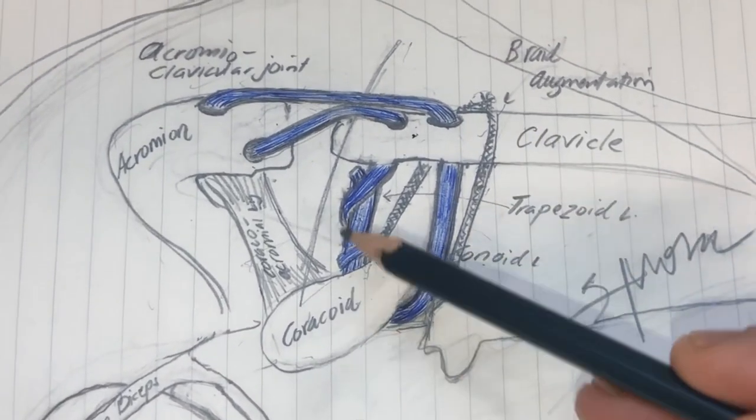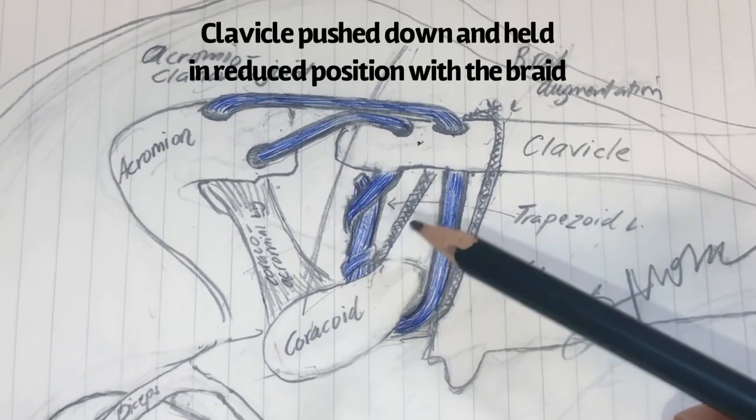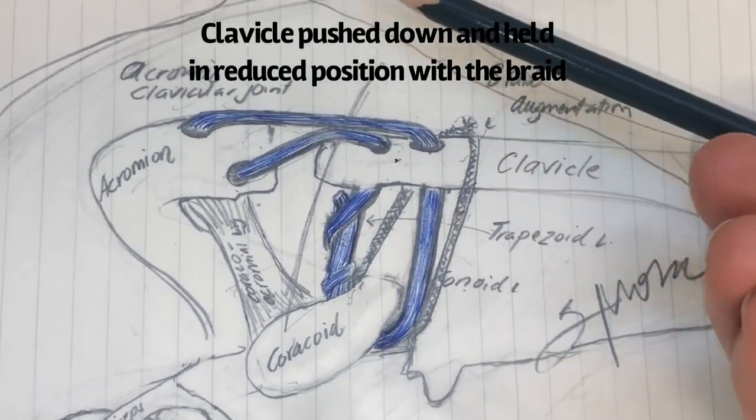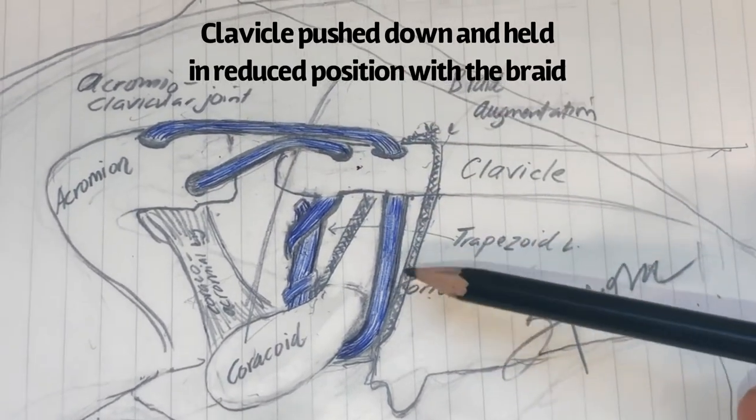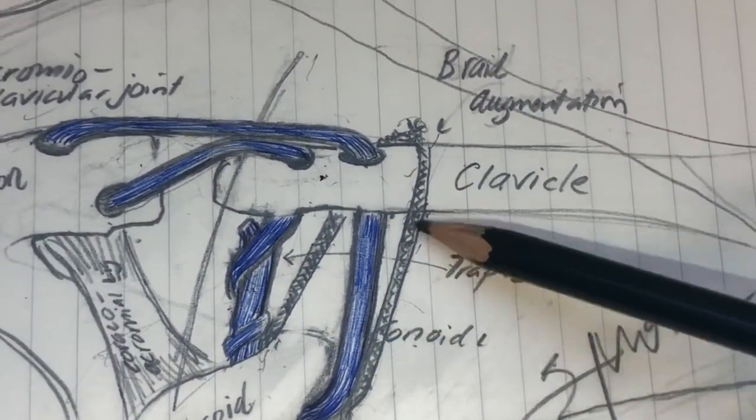Once I loop both structures through, our passable structures, then I reduce the clavicle, bring it down, line it up with the acromion, and I secure it with this braid.